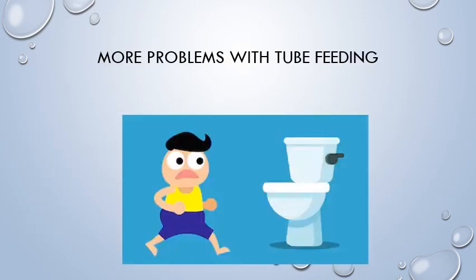If an individual with a feeding tube develops an increased number of bowel movements or liquid bowel movements, notify the delegating nurse. Diarrhea may be accompanied by pain, cramping of the stomach, fever, or lightheadedness. Diarrhea may simply be due to the supplement. It may also be caused by soap film left on the feeding bag or medications. It may also be a sign of a serious bowel infection. Do not administer anti-diarrheal medications unless specifically instructed to do so by the delegating nurse.